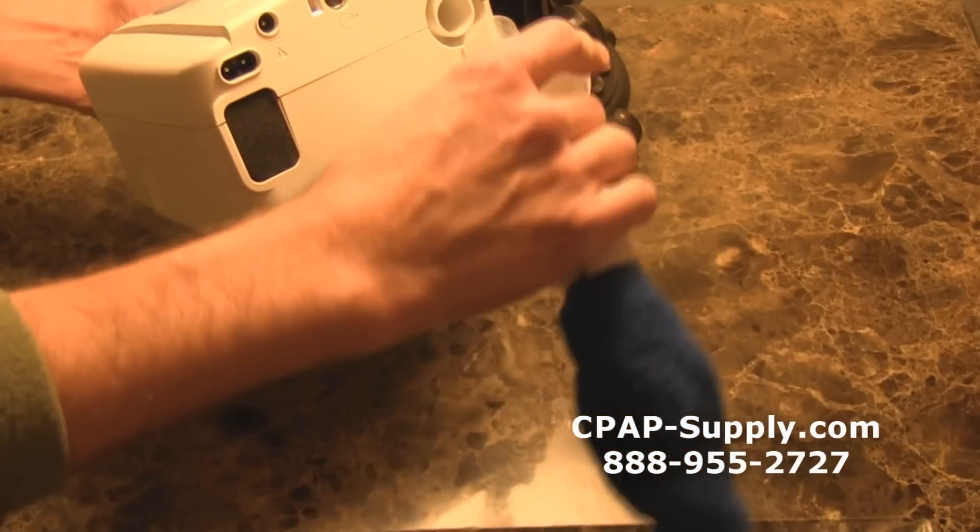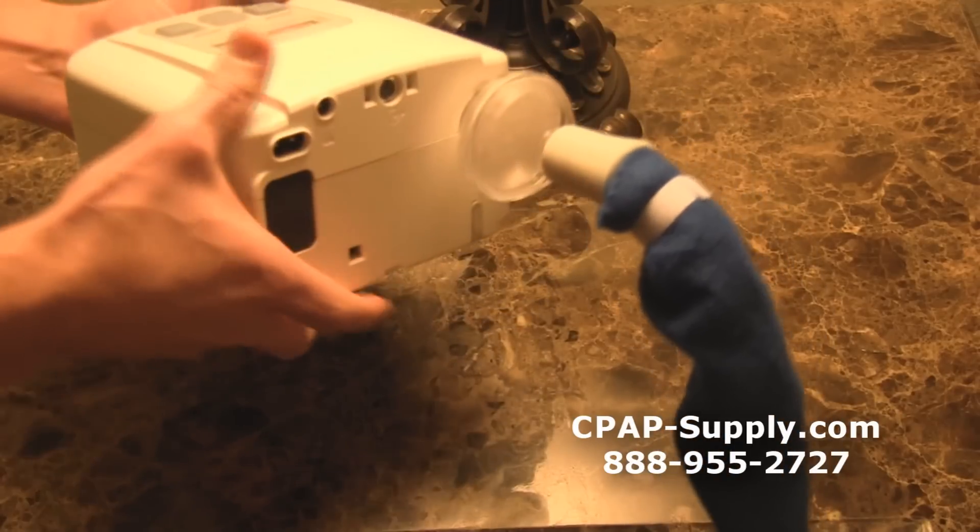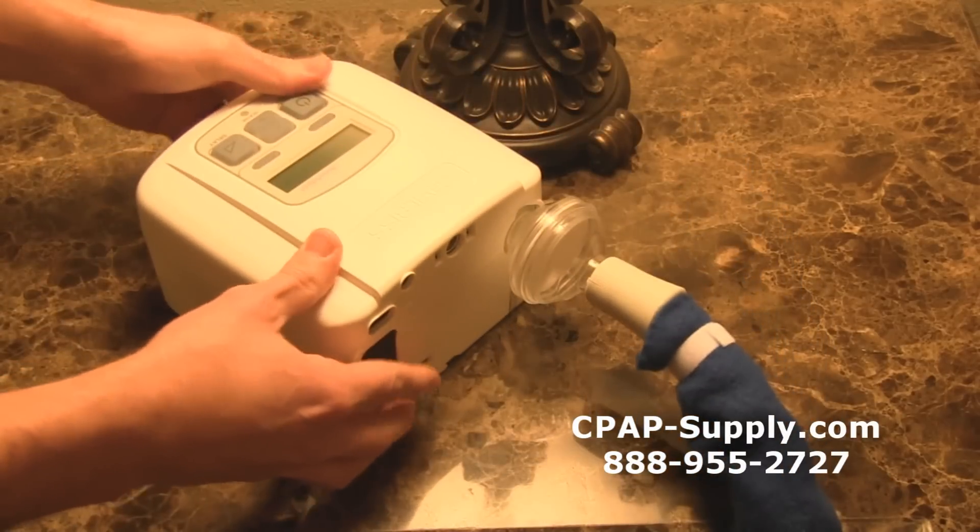The filter is compatible with most CPAP machines and all CPAP tubes. If you're looking for another layer of filtration in your CPAP setup, then look no further.